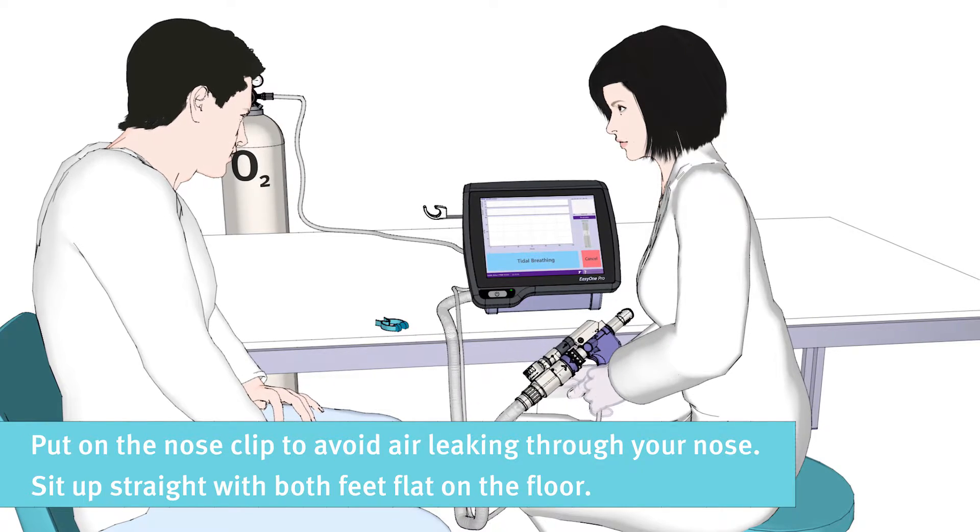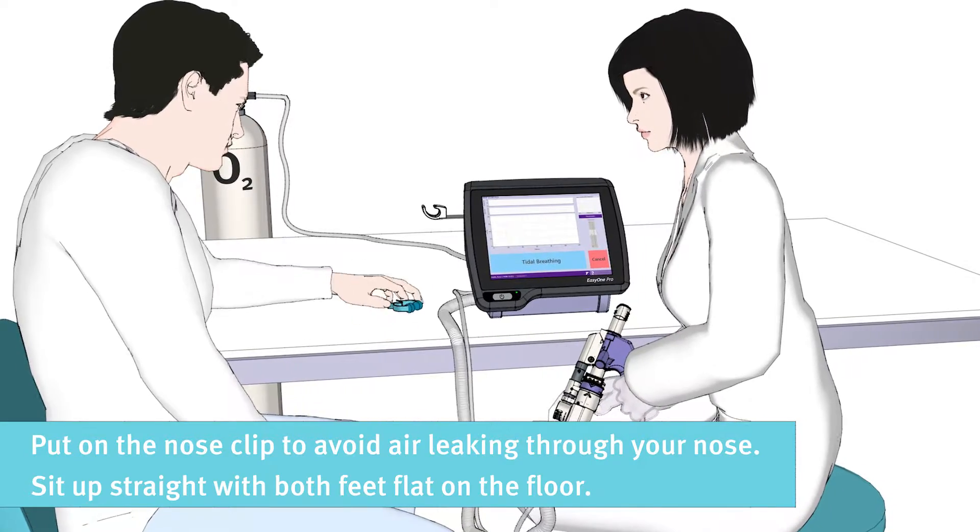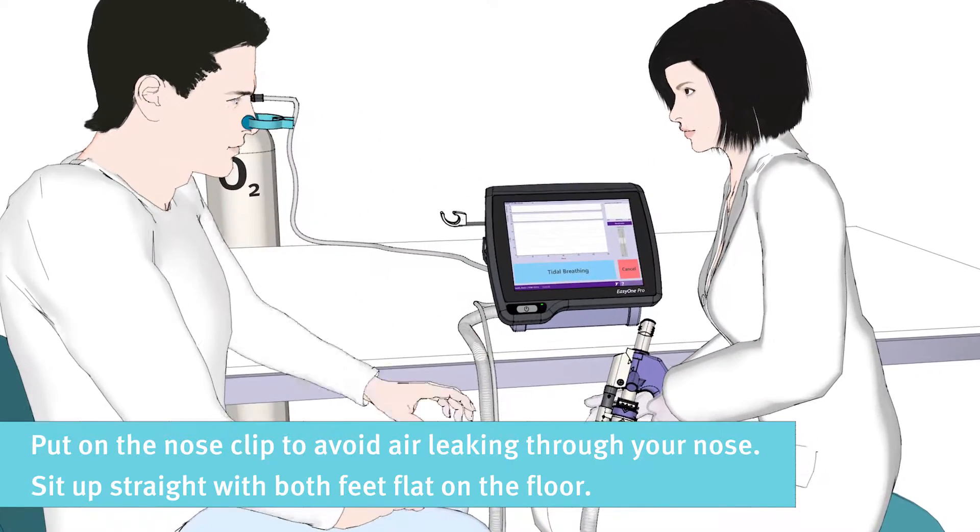The nose clip is important to make sure no air leaks through your nose while performing the test. Please sit up straight with both feet flat on the floor.